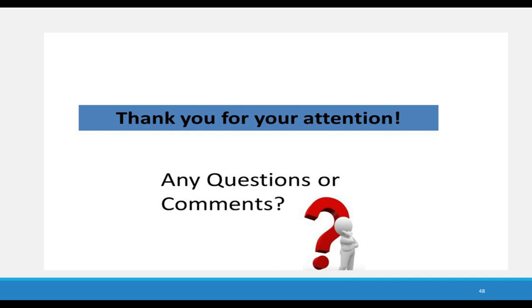I think that I understand this question in that it would prevent you from having to do a send out. Of course, the panel covers the 3 most common parasites. You might still have to send out a few things if the clinicians want to investigate other parasitic possibilities. But I think it's a wonderful option for bringing your parasitology screening into your laboratory and preventing send-out tests. I think that would be a wonderful application of that enteric parasite panel.